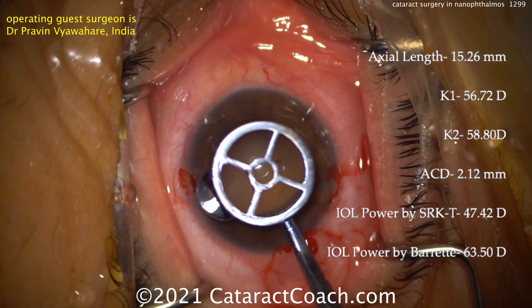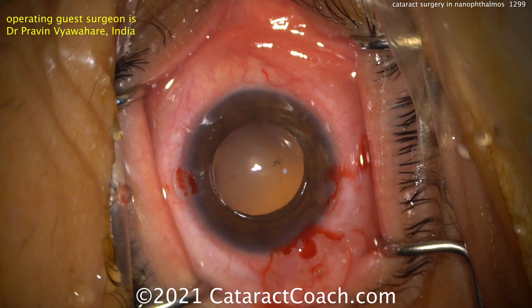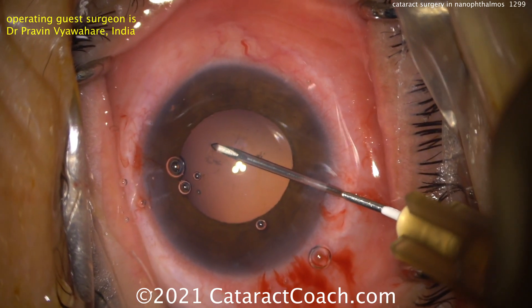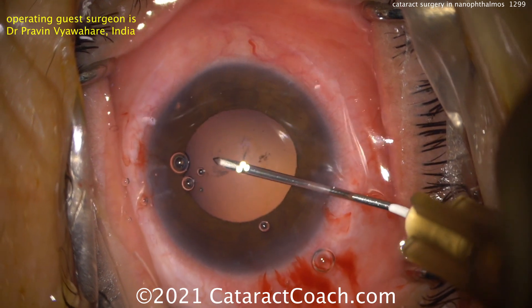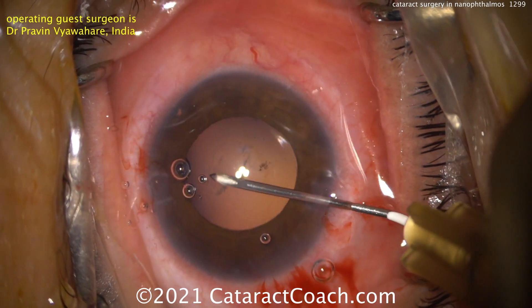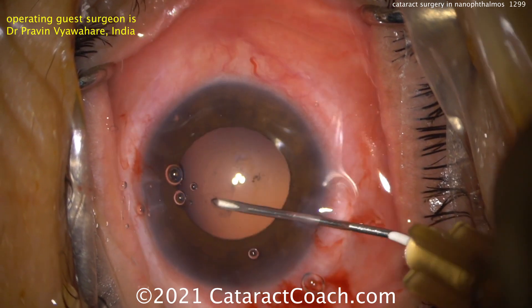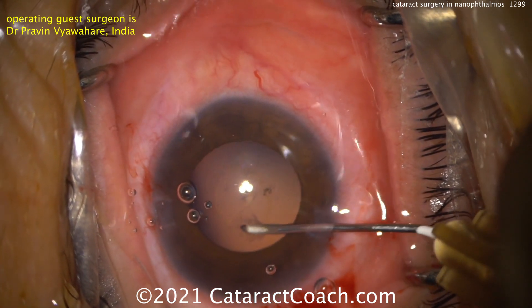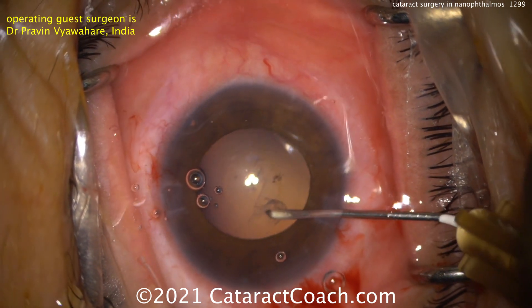This is the rhexis marker, just marking off a 5mm zone — and you can see that's how big 5mm is. Making a rhexis right up against the pupil margin is 5mm. The white-to-white size is obviously very small. These nanophthalmic eyes are tough, so I like that he's using the side port paracentesis to really get that rhexis going with the cystotome.